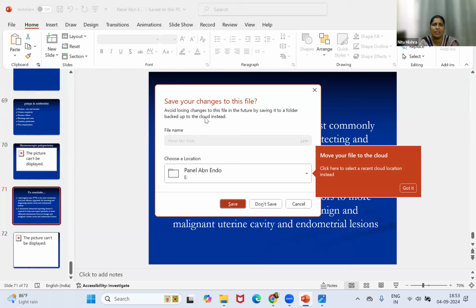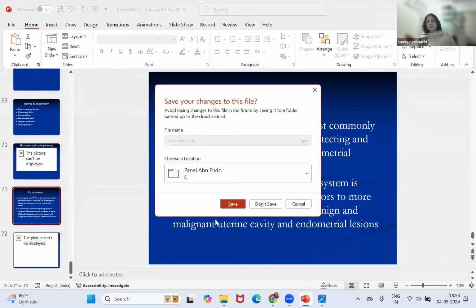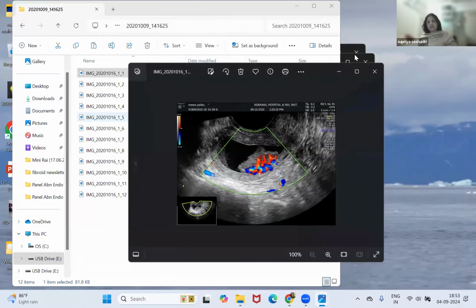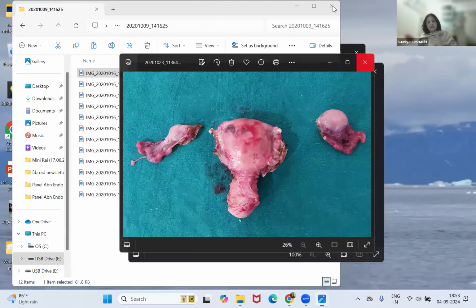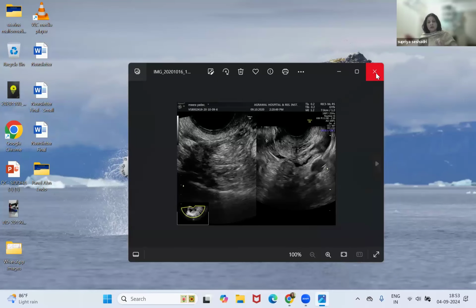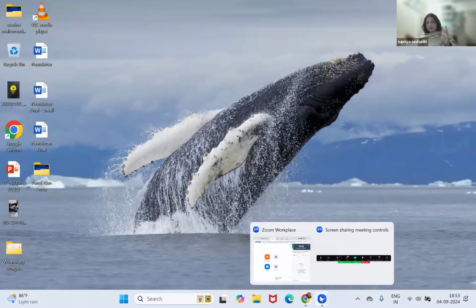What are the different criteria to define enhanced myometrial vascularity? Okay, one is pregnancy; it's a pregnancy-related event. Number two, when we do a scan and a sweep, there is a break in the endomyometrial junction. At this break, we see a tubular, serpentinous, snaky-like structure, which can be anechoic or hypoechoic, going from the endometrium to the myometrium. When we put on color, the hallmark feature is aliasing. Aliasing means you don't get a pure blue or red, you get a mixture of blue and red. Now you might ask me, a mixture of blue and red may be due to technical factors.